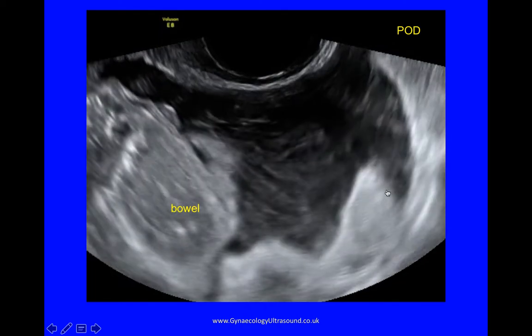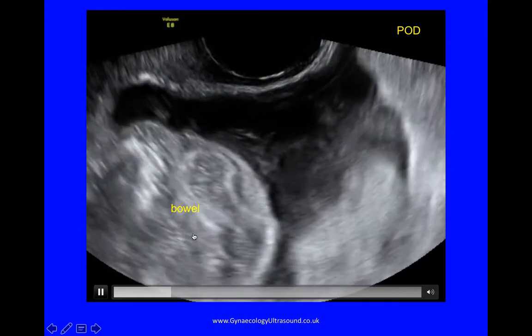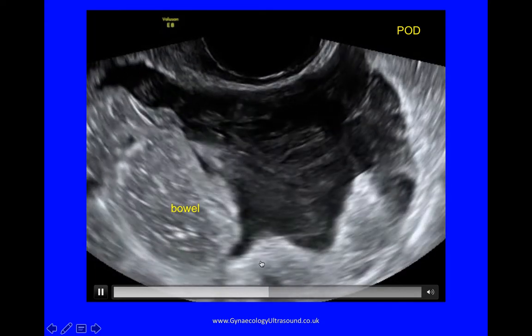This is a video of a transvaginal view of the pouch of Douglas. There's some bowel here. This is the pouch of Douglas.